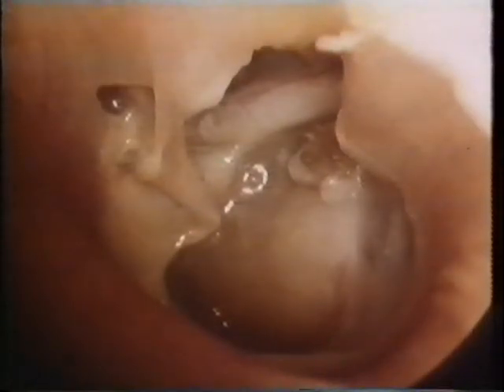The light reflex can be seen well here. One should also view the lateral process and the handle of the malleus, the umbo, the pars flaccida, and the pars tensa of the tympanic membrane, and the posterior meatal wall. Perforation of the tympanic membrane, as seen here in the central pars tensa, should be identified. Marginal perforations, including those in the attic, and especially if they show granulation tissue or keratin, are evidence of dangerous disease, as they may indicate bone erosion with a risk of meningitis or of a brain abscess.